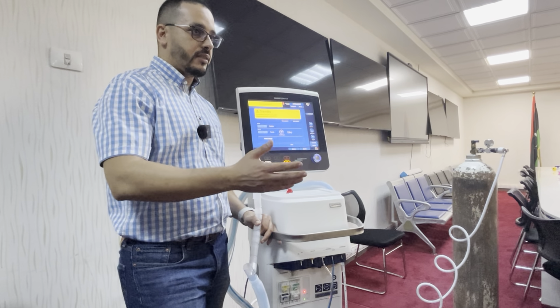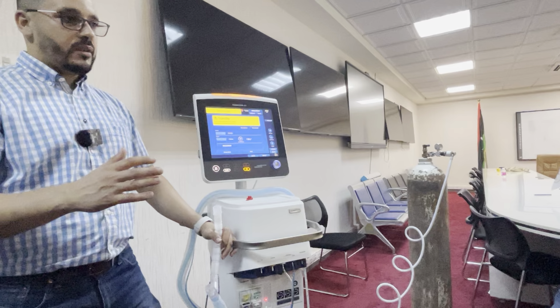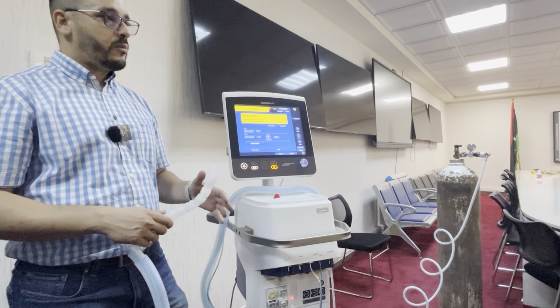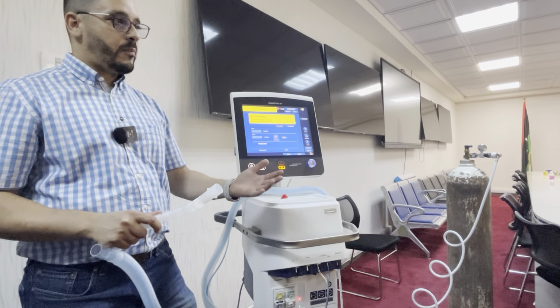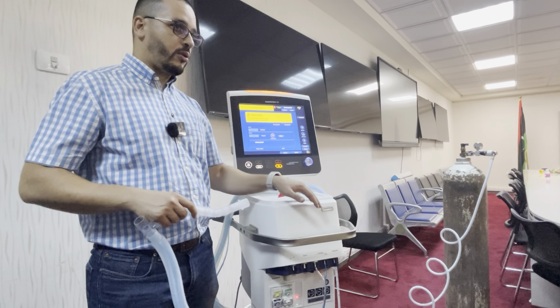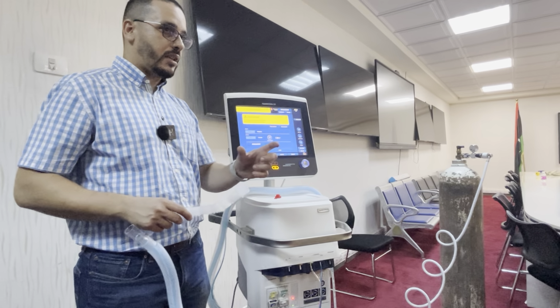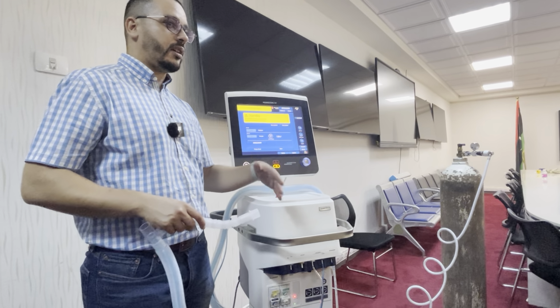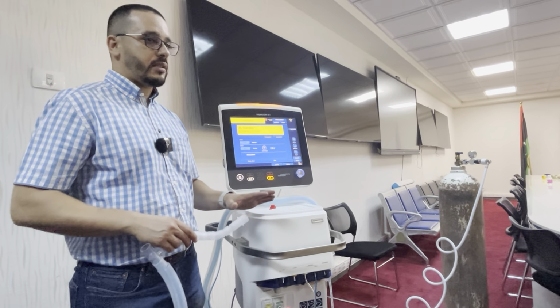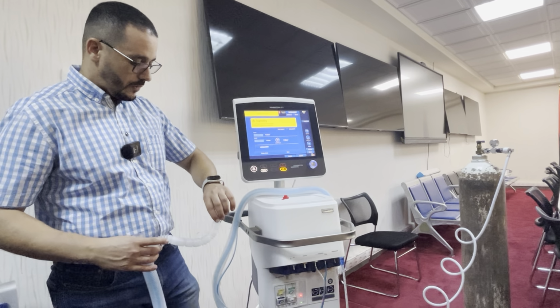It's a different story. So that's why most of the time we say that if the patient is not staying a long time connected to the ventilator, we can use a normal anesthesia circuit for short stays only. But if he will be connected for a long period, it's mandatory to use the humidifier. Okay?